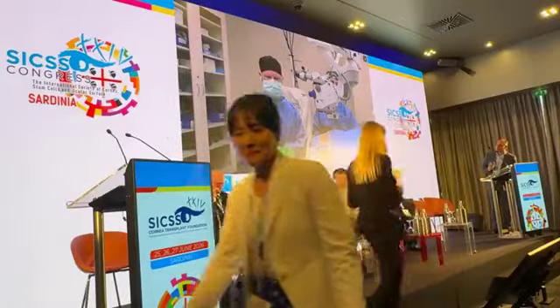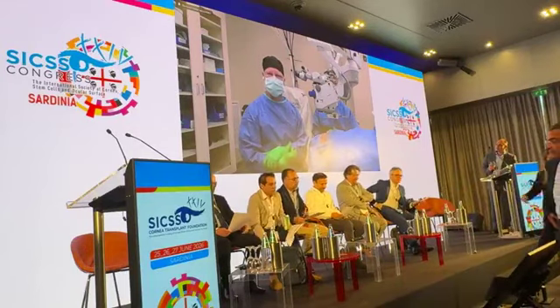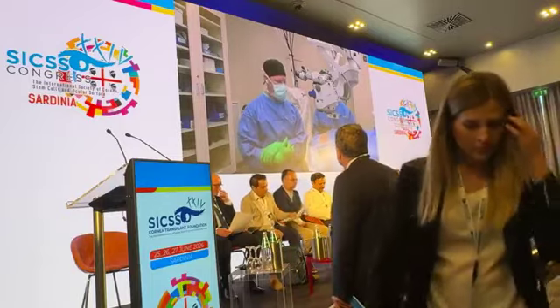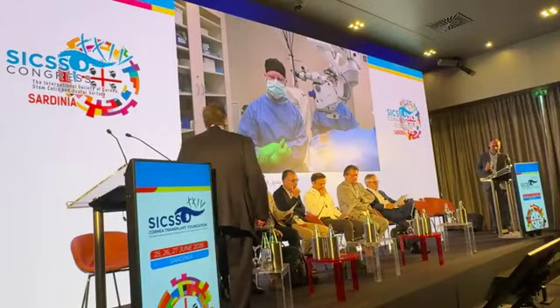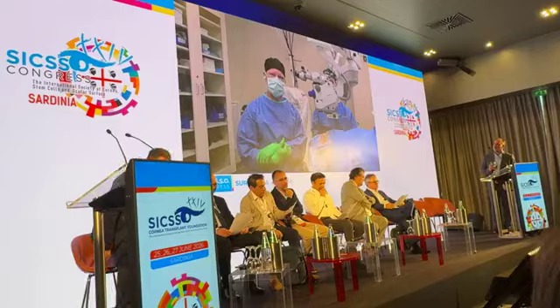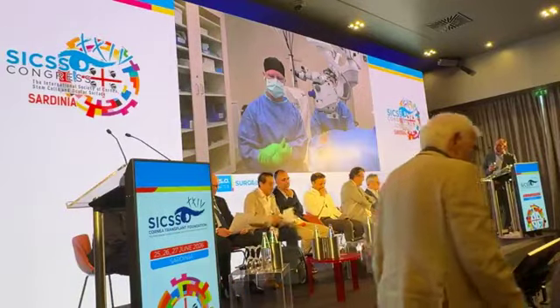So if I understand correctly, you'll be showing us a CTAC procedure, correct? Yeah, we're going to do a CTAC live on Zoom for you. And you've already done the femtosecond pocket? Yeah, our patient's right here, ready to go. He knows he's being recorded or streamed, but we're ready to start the surgical procedure. I'll go over what we did at the laser so we can catch the audience up to where we're at. Okay, that's great. Please go ahead.